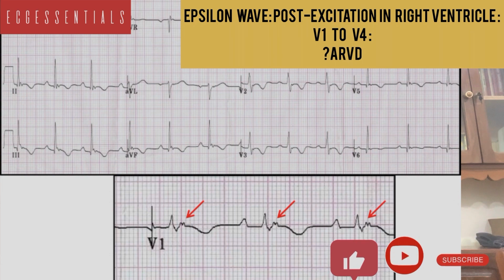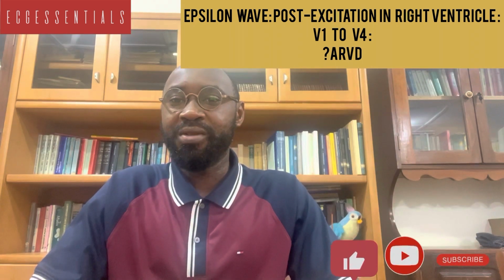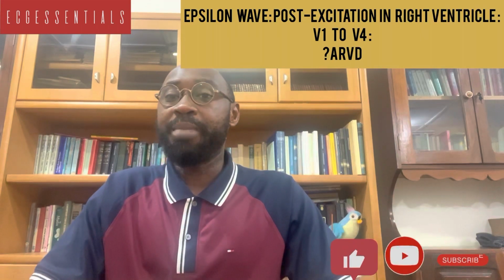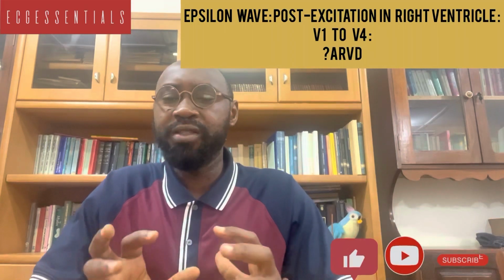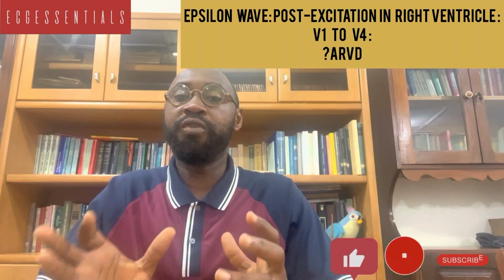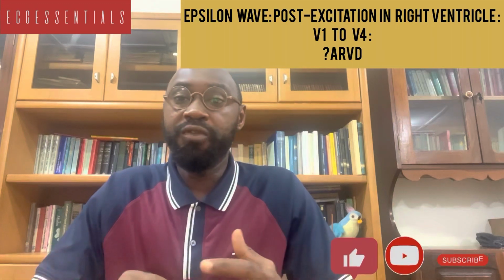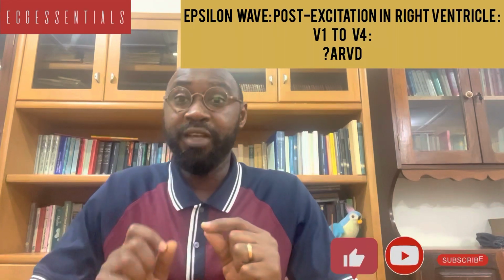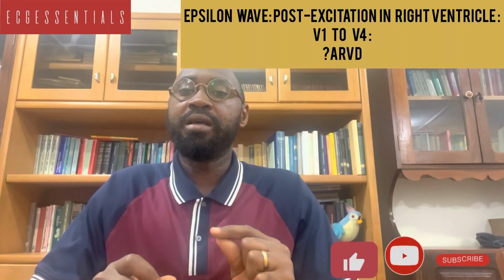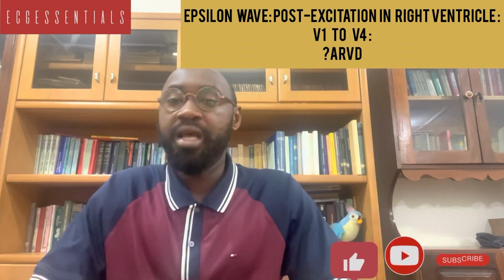Whereas the delta wave represents a pre-excitation of the ventricles, the epsilon wave represents a post-excitation of the myocytes, this time in the right ventricle. If we find these epsilon waves, we may most likely find them in leads V1 to V2, V4, the anterior leads. And if they are there, then they are considered significant for arrhythmogenic right ventricular dysplasia.